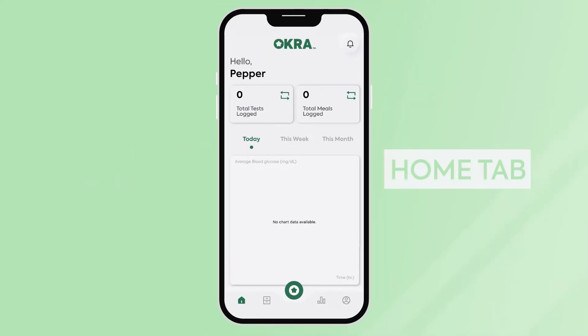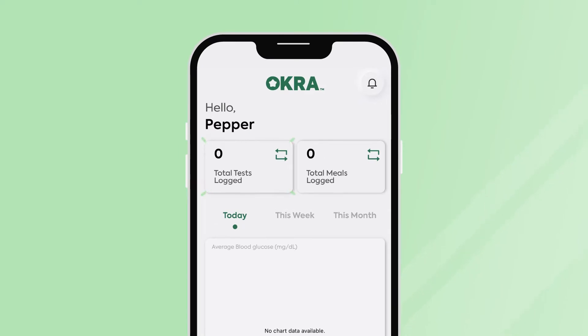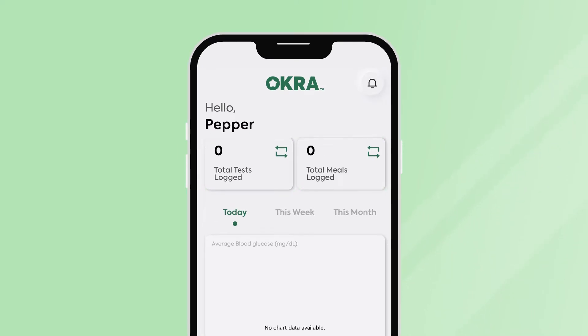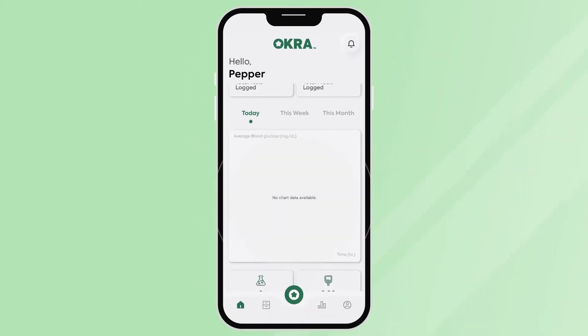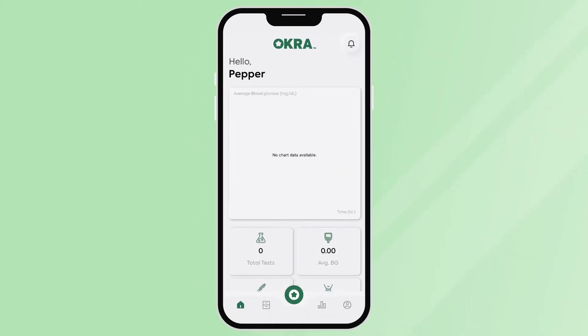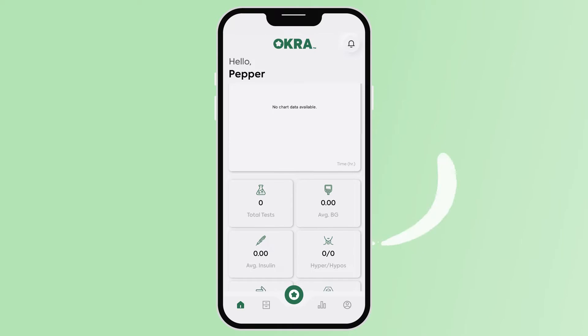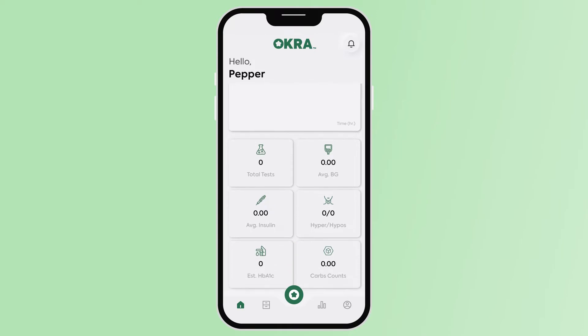Here, you will be able to see the total number of tests logged, the total number of meals logged, data chart, and a breakdown of your daily logged test results.